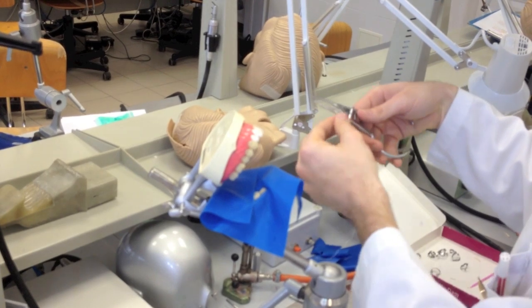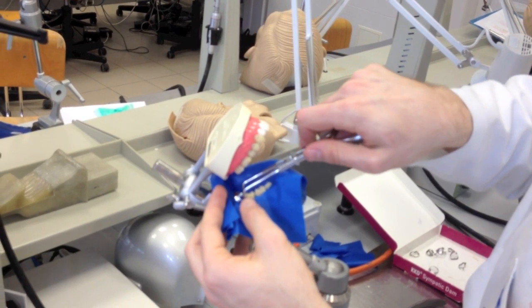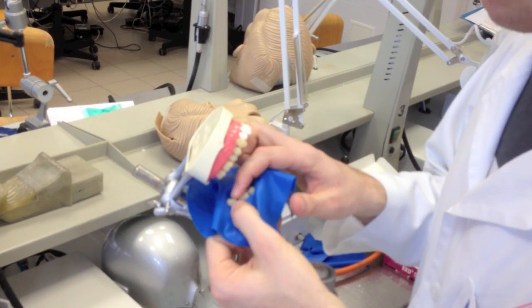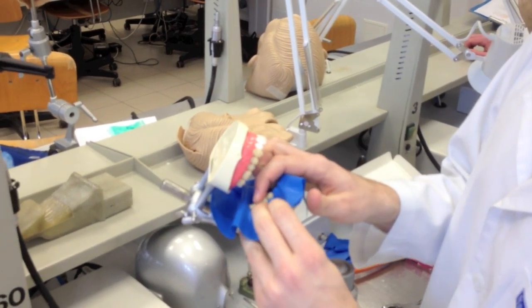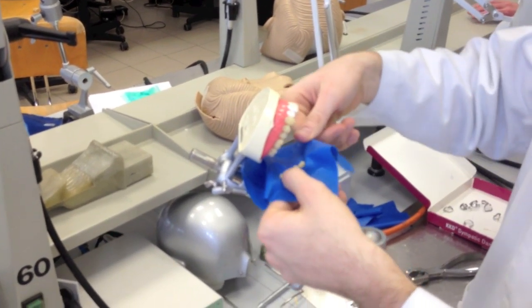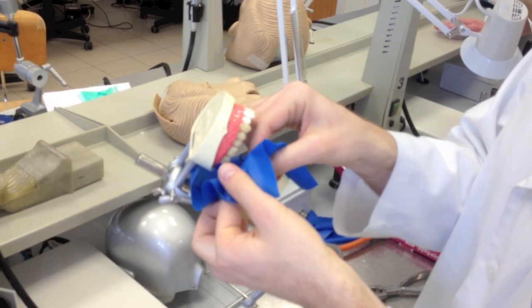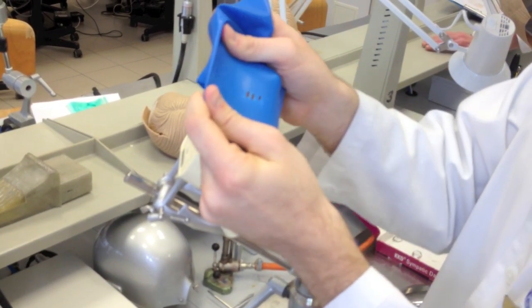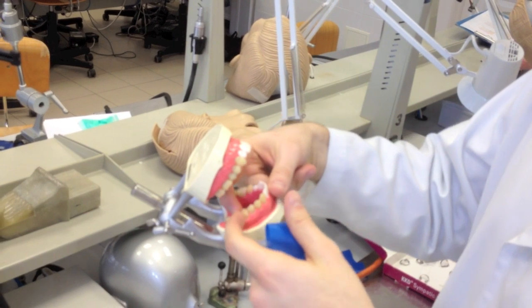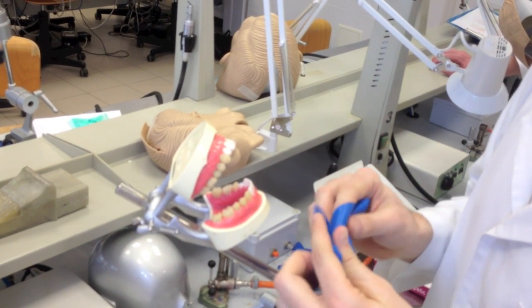When we're done, remove the clamp. If you made an MOD or some second-class filling, maybe the approximate contact point is very tight. In that case, sometimes you cannot remove it just by pulling — you have to cut these parts with scissors. Always check when you have removed the rubber dam that you have all the parts, because it can happen that it's torn into that area. You have to look for it and remove it, because it can start quite serious gingivitis.